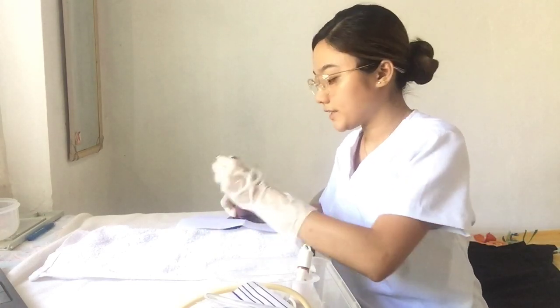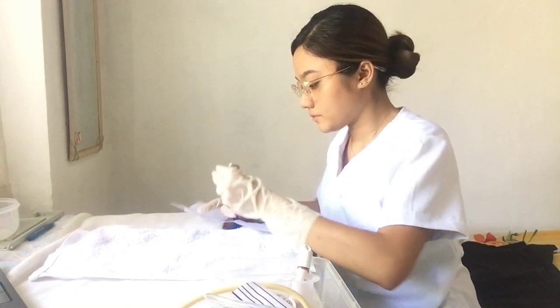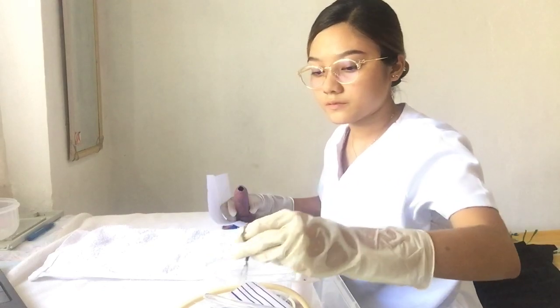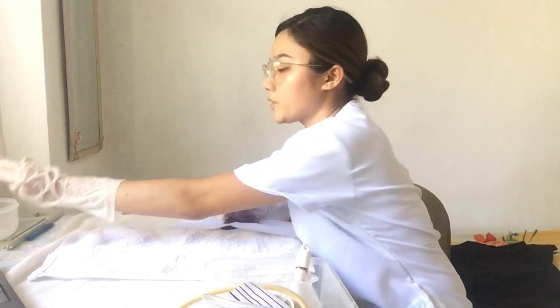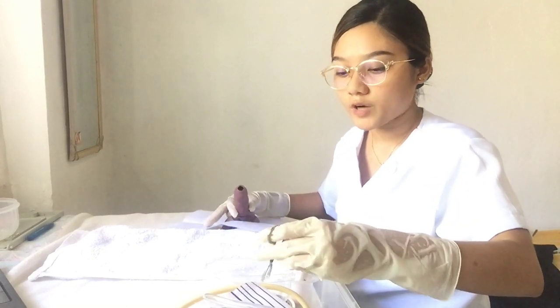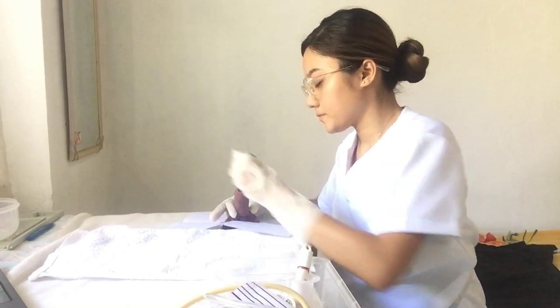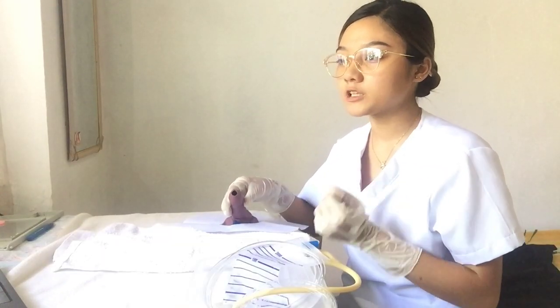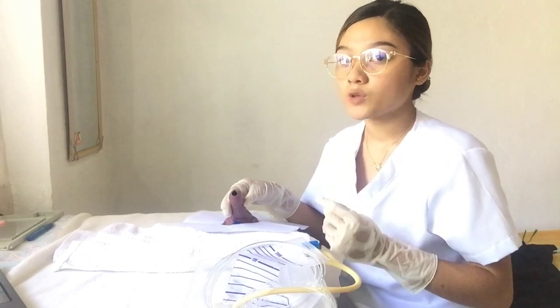Do this three or four times. After that, use a dry cotton ball to dry the area. Next, hold the penis slightly upward with tension, perpendicular to the patient's body, then lubricate the catheter well with lubricant or lidocaine.